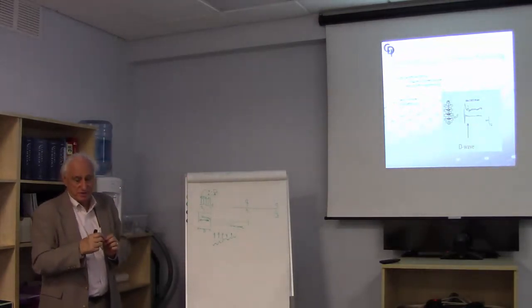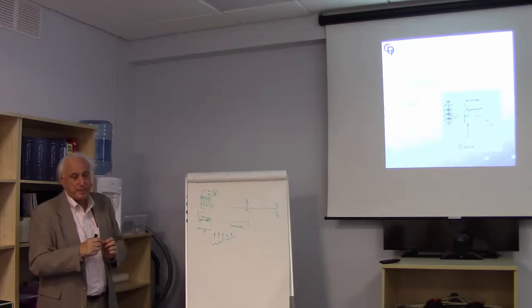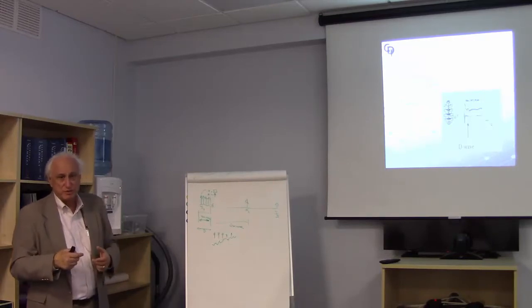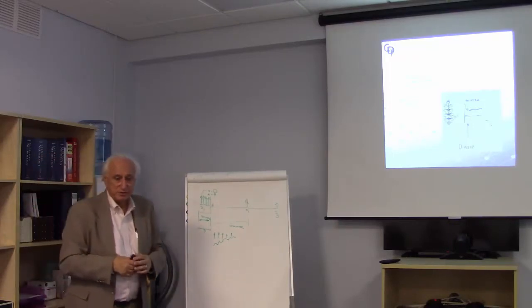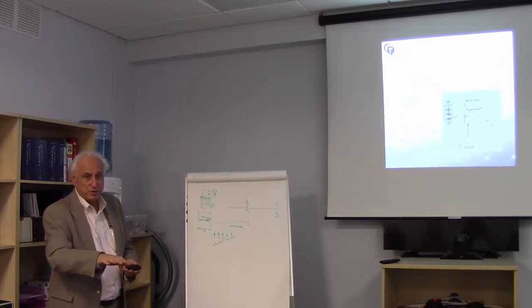actually using the same kind of contact grids that we use for recording from the cortex. So you can only do this in operations where there's a laminectomy done. The surgeon can then slide the grid down over the cord.